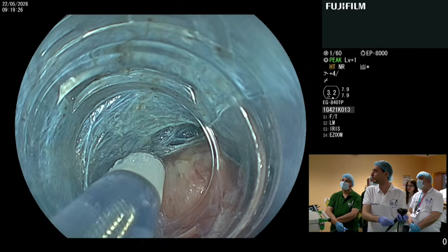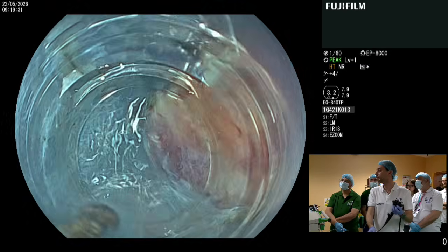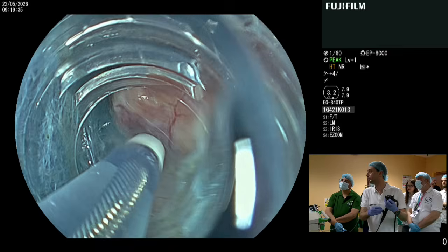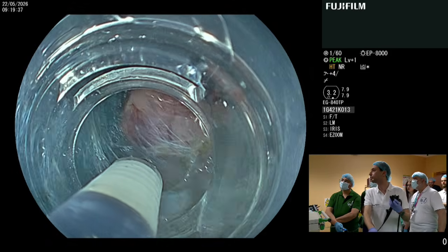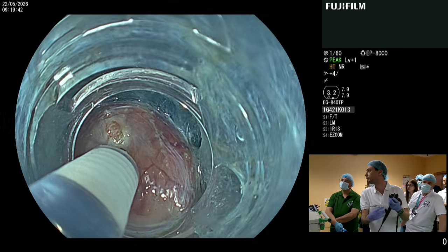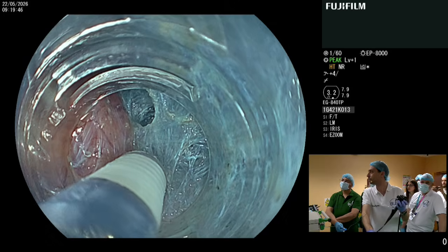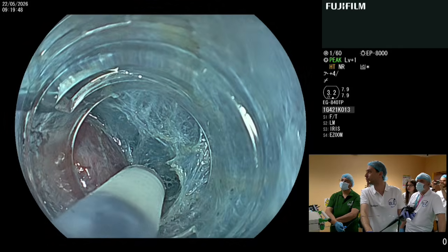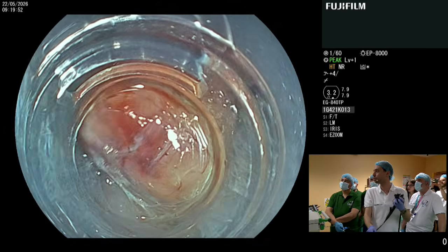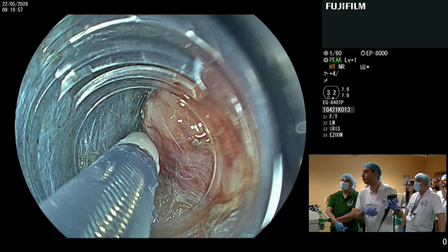In addition, in 2026, we have many devices for closure. So we are much safer. So the difficult part will be to go beyond at the posterior part of the tumor. If I fail, I can still convert the procedure to standard, let's say, ESD, and open the mucosal cap.